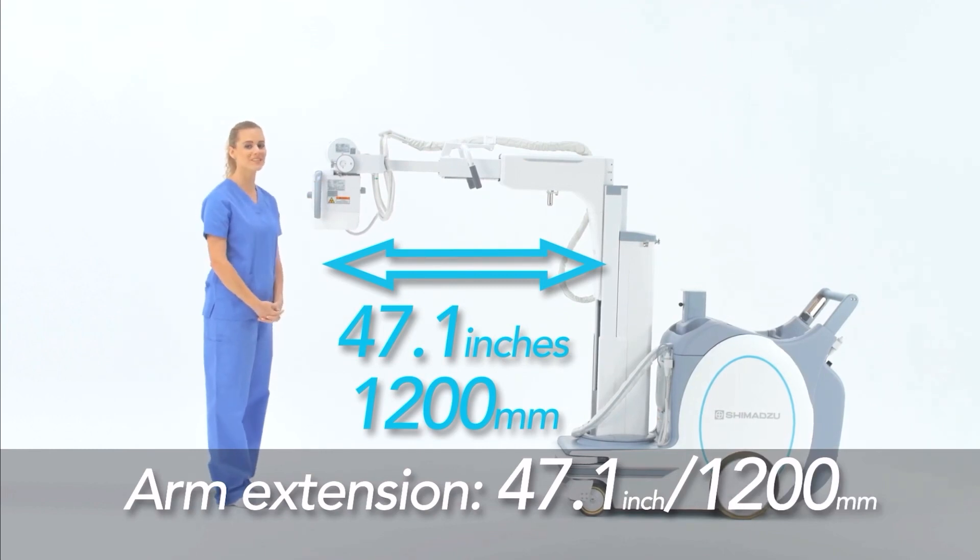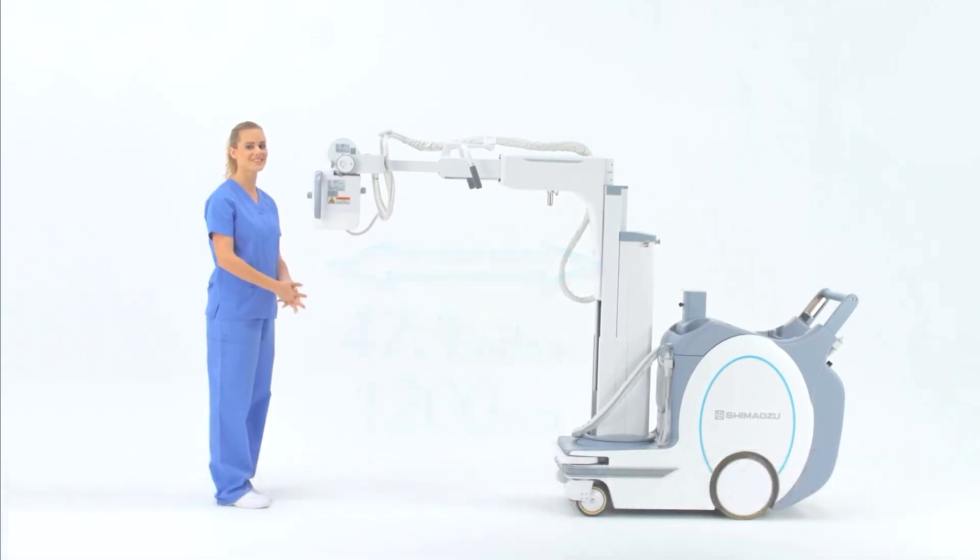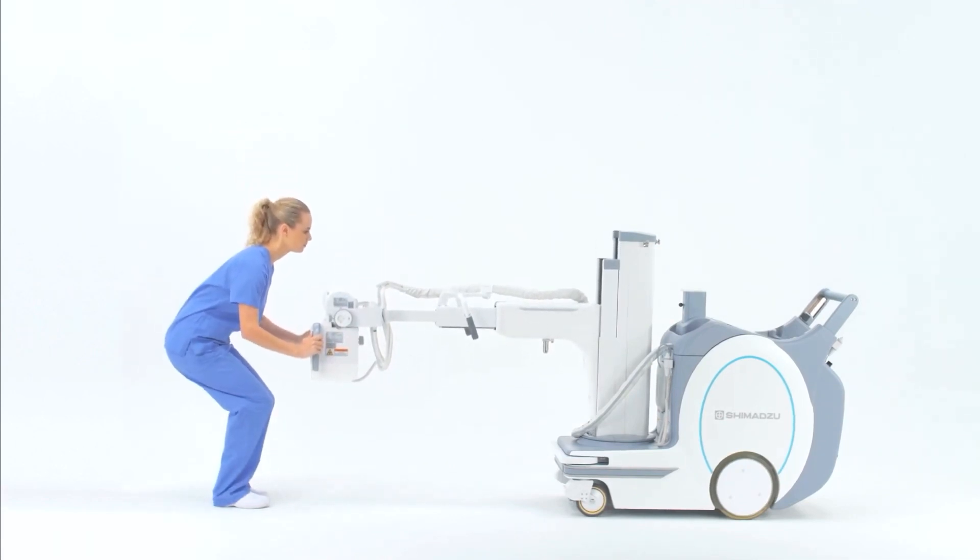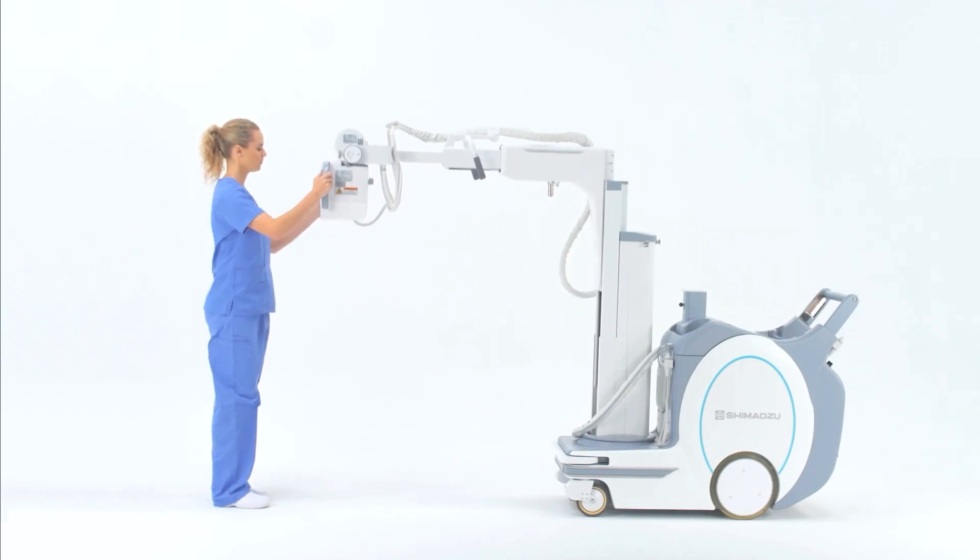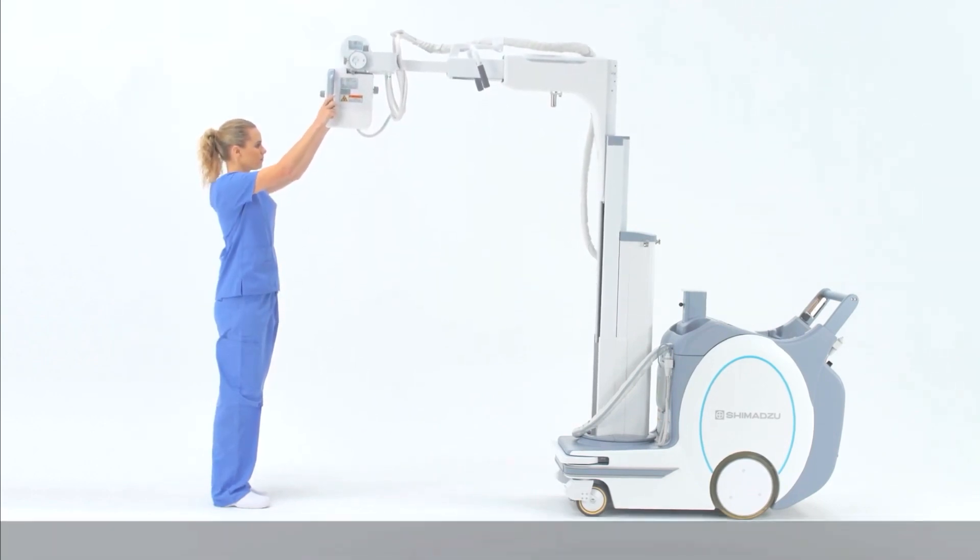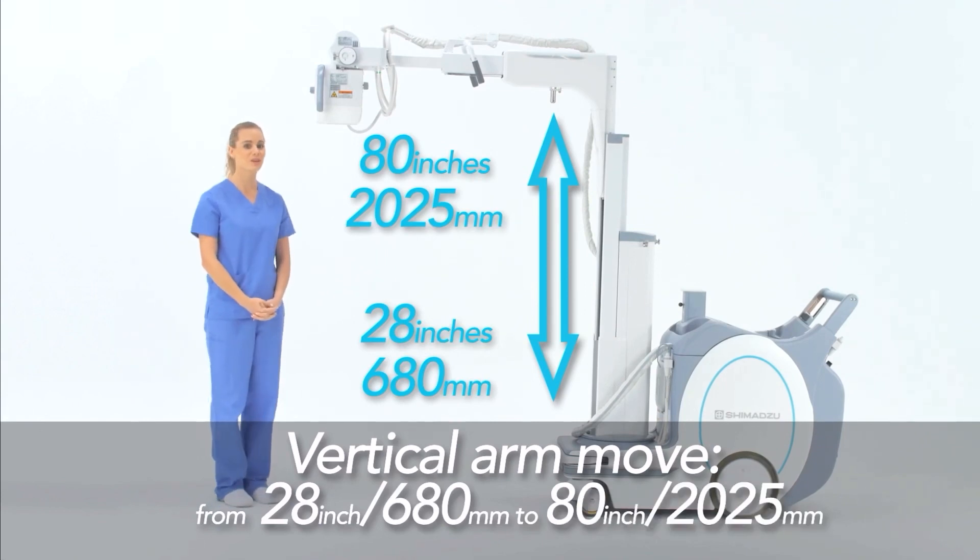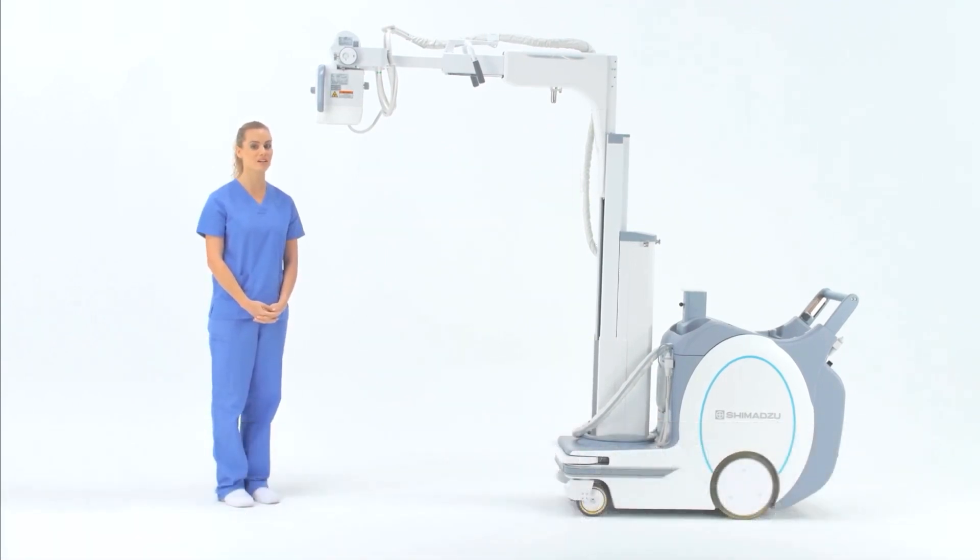The arm is capable of extending up to 47 inches. The X-ray tube can move vertically from 28 inches up to 80 inches off of the floor, which allows positioning to be completed in one simple step.